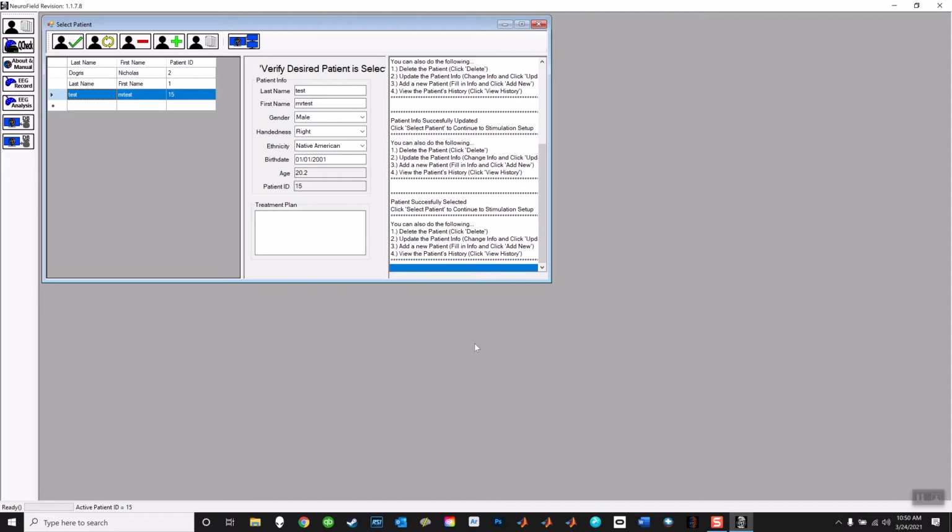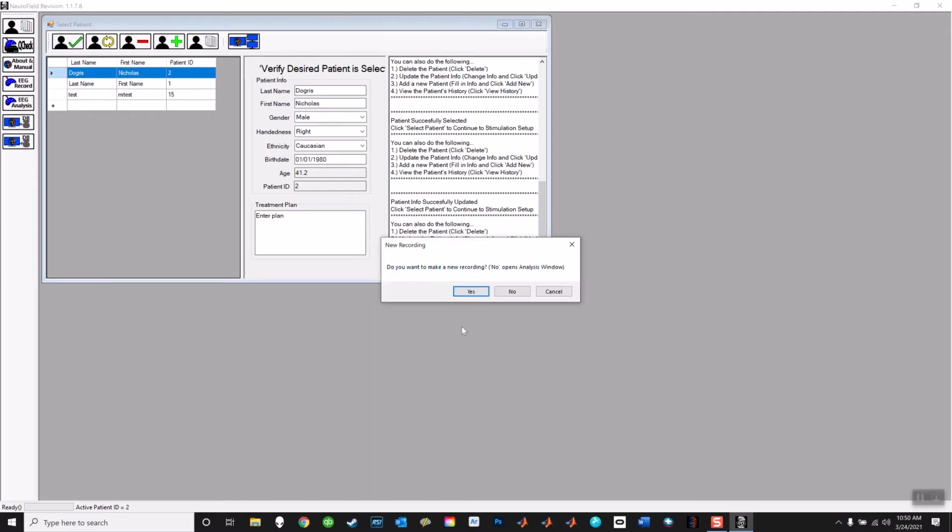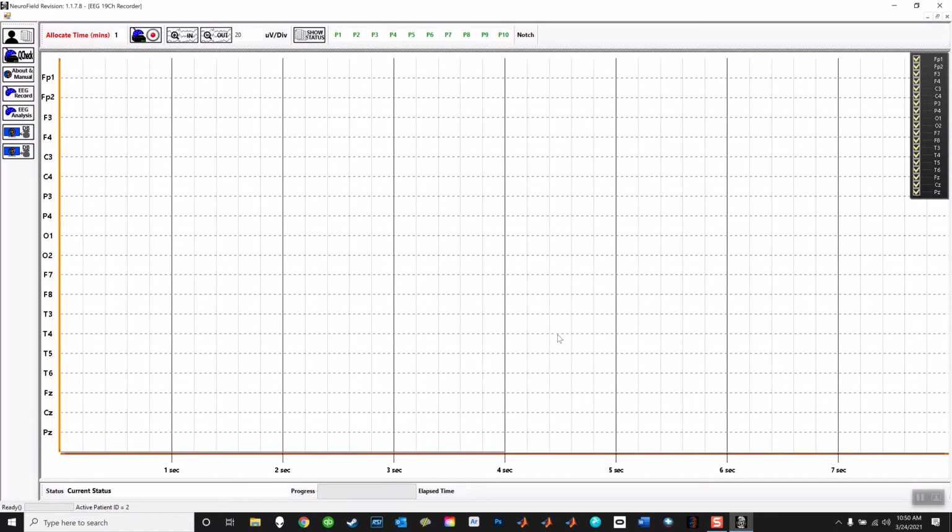All right, now we're going to move forward here, and I'm going to select me as a patient. Once I'm selected, I'm going to click on the little check button, and it's going to open up this little window. It's going to say, do you want to make a new recording? Yes or no? Yes is going to take us to the recording screen. No will take us to the analysis screen. Well, I want to make a new recording, so I'm going to click on yes.